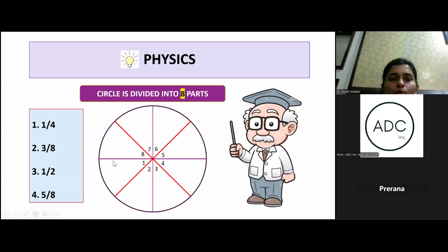So if I have to involve 8 equal parts, means each of the parts is 1/8, correct? Do you all agree with me? So if I have to involve 2 parts, if I have to draw an arc which involves 2 parts of the circle, like this, okay? That is like 1/8 plus 1/8, that is 2/8, that is 1/4. So that becomes my 1/4 type of suture needle, okay?